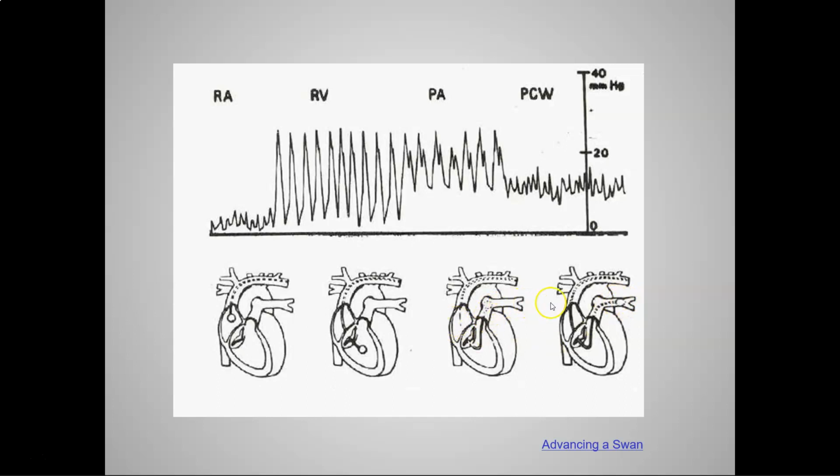Okay, we move through, boom, pulmonary artery. I'm where I need to be now. Okay, I'm there, I'm present, and this is the waveform we're going to see. It almost looks identical to that right atria. But we're in place now, and you're going to see a much smaller waveform, and we're looking to measure these peak waves. This balloon does not stay inflated.